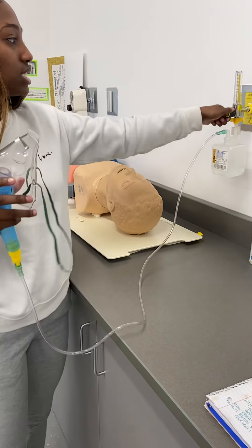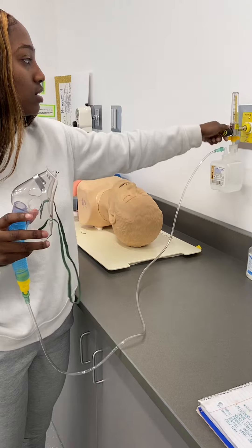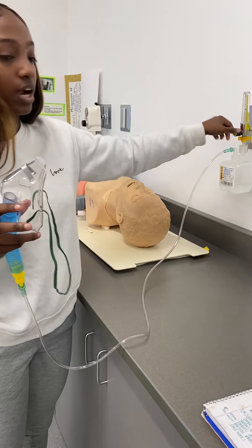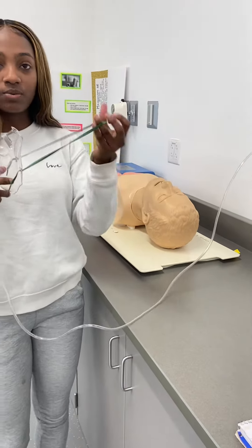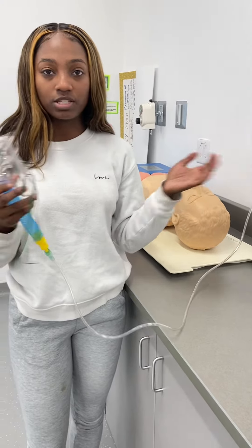Turn the flow up to 6, and you would just wrap this around the patient's head — and that's how you would administer the oxygen.